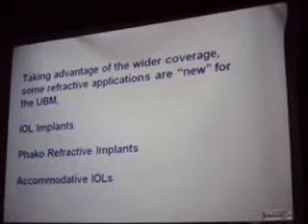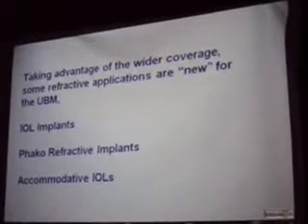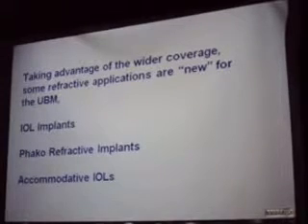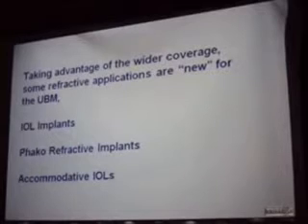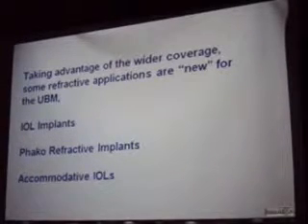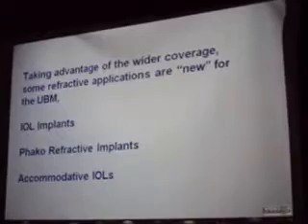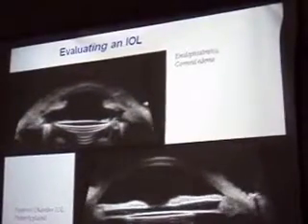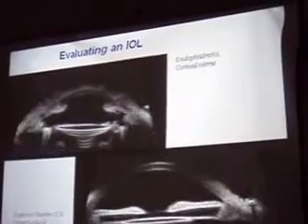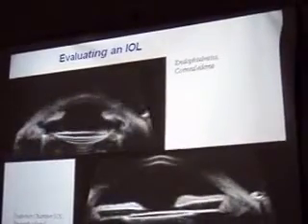Also, the phaco-refractive implants, which are going to be extensively talked about in the next presentation. And finally, accommodative IOLs with the ability to show motion inside the eye. Here is a very simple example of how we can evaluate an IOL.